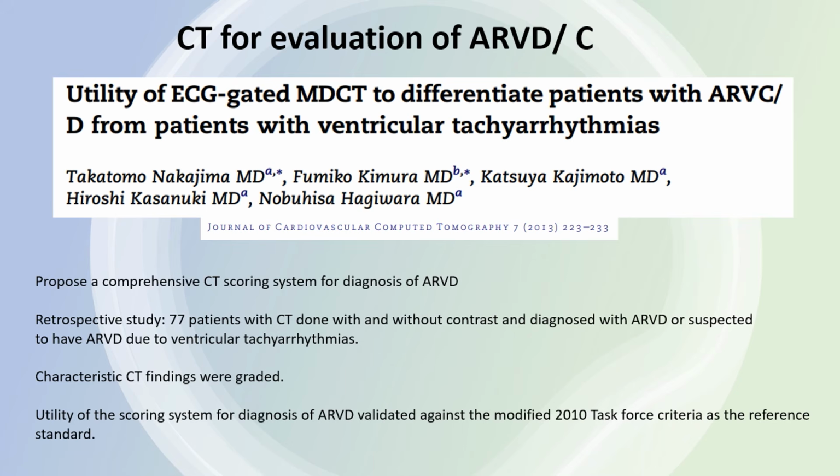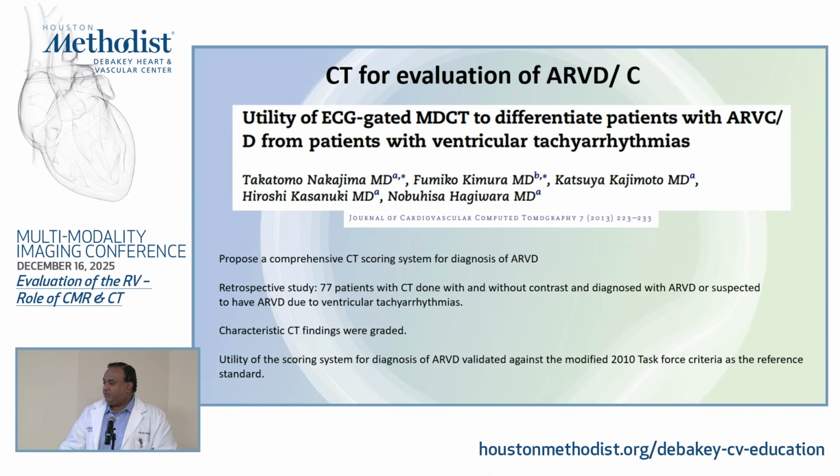CT can be helpful in evaluation of ARVD. This group from Japan published this paper in JCCT in 2013, where they tried to come up with a CT scoring system for diagnosis of ARVD. The study was looking at 77 patients retrospectively over the preceding 4 years who had a CT done with and without contrast and were suspected of having ARVD.